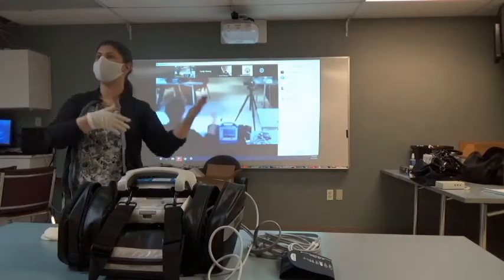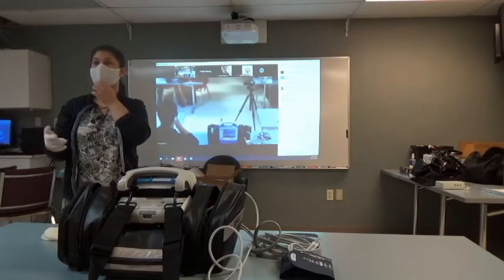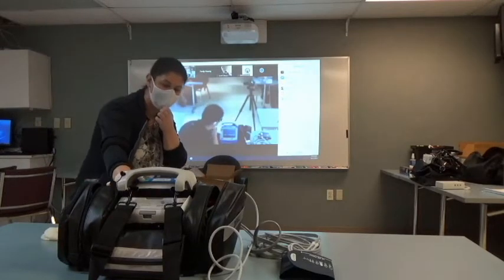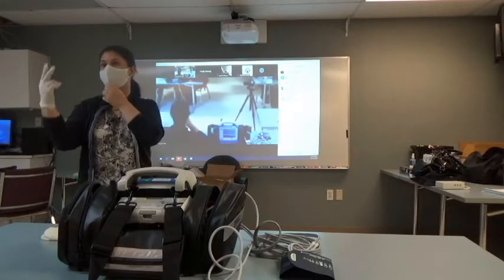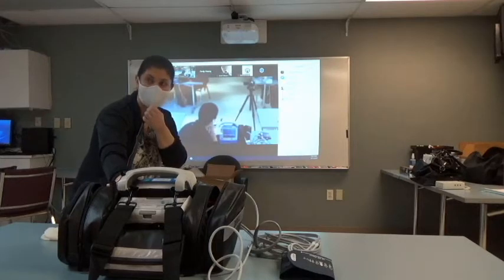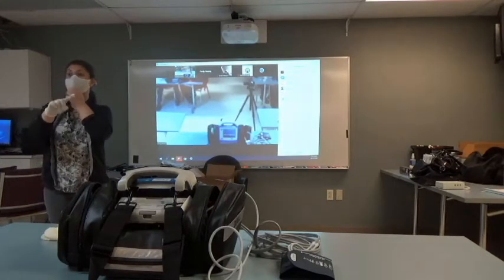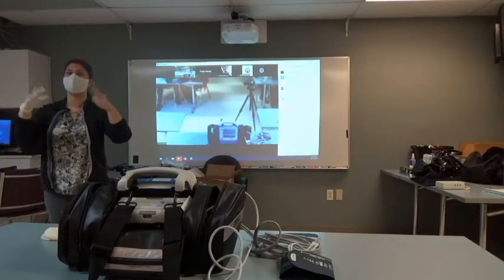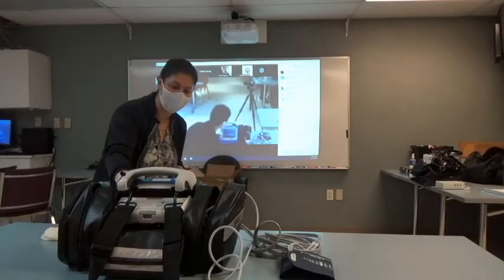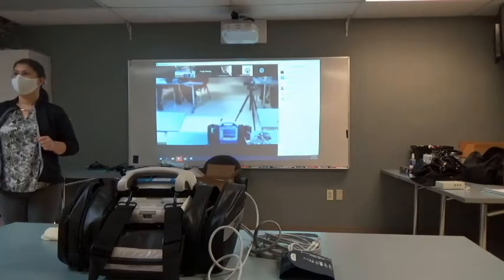So for instance, if I was working in Florida right now, and I came on somebody who is asystole, and my protocol requires me to confirm in 2 or more leads, I would go over to PADS, which would now be really lead 2 because it switches over when you place them on the 4 lead. I would go down to insert, and I would put lead 3 up there. Now I've got 2, but that's only going to be for this call. That way when I turn it on for the next one, it's not overly crowded. Does that answer your question? Yes, thank you. You're welcome. And then I can remove that as well by going down to remove. Everybody good?